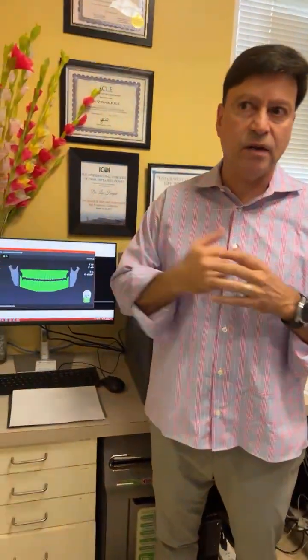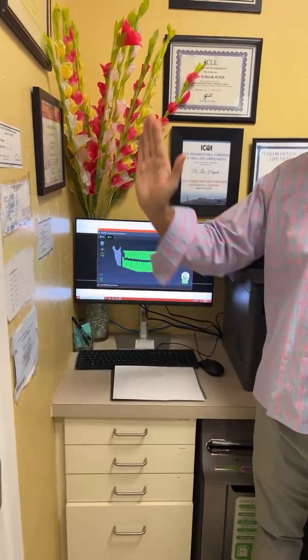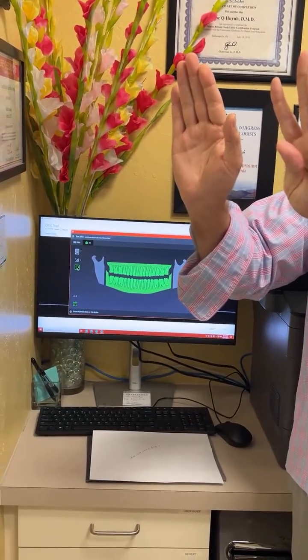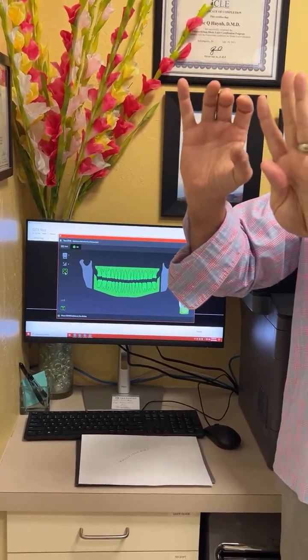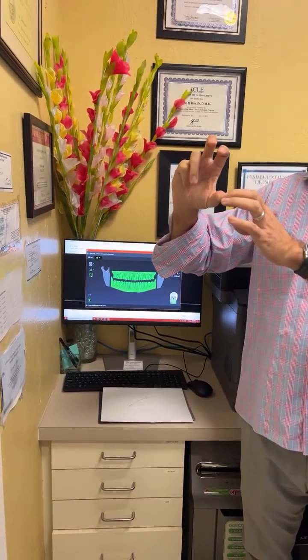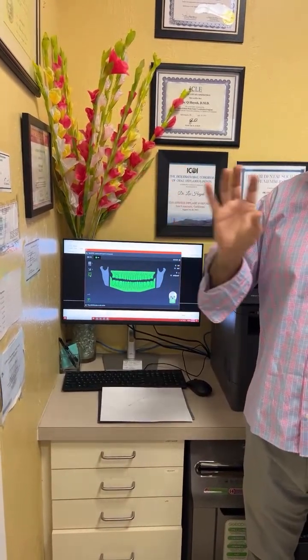So let's say doctor said we're doing an implant on number 3. You think you have it set up properly. The patient's in the machine. You do the scout. You get a lateral and frontal. And you're going to look at it and go, you know what? I don't have enough sinus. If I take this right now, doc's not going to be happy because I didn't get enough of the sinus. Or I didn't get the opposing crowns. So in the software, we allow you to adjust it.